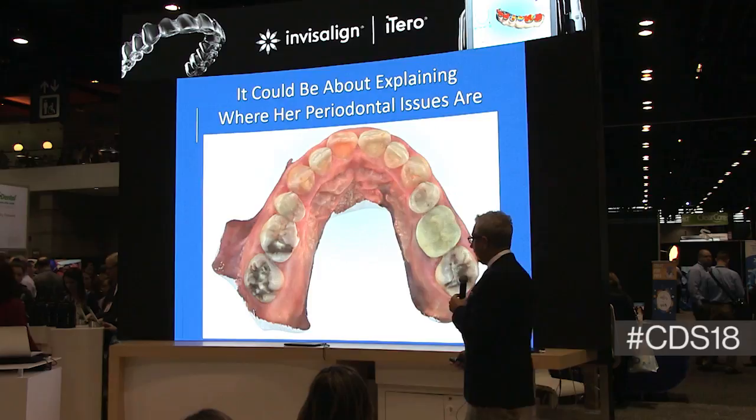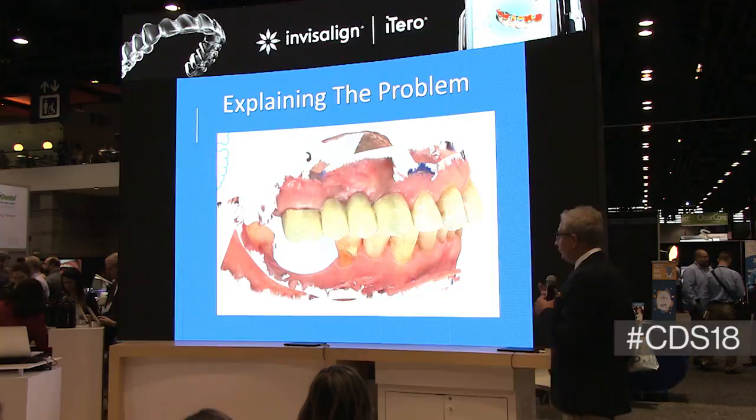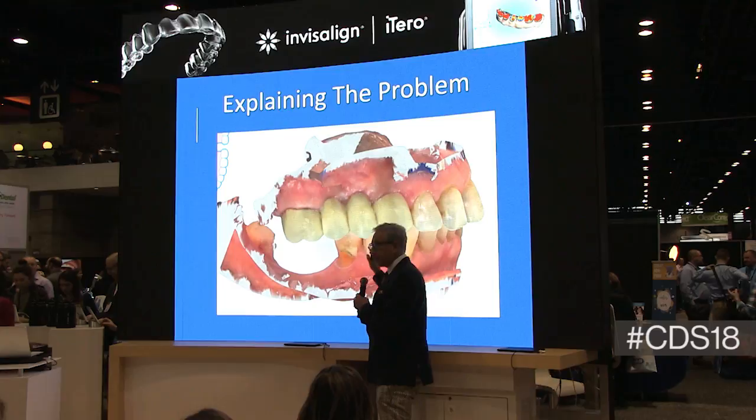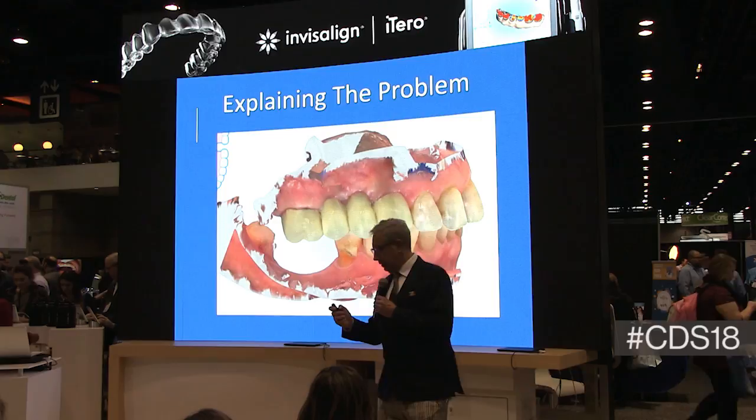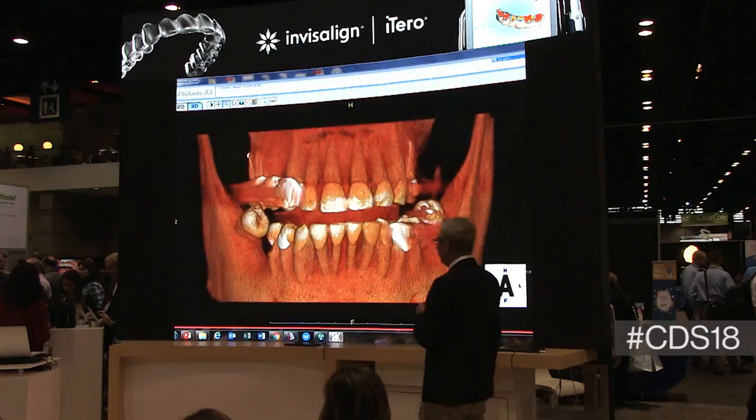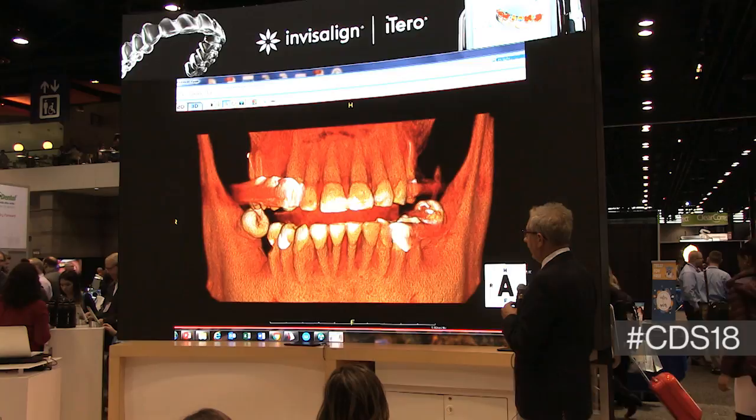This is Jean. Jean comes in, and she's got multiple problems. My assistant takes 5 minutes, 2.5 minutes upper arch, 2.5 minutes lower arch, and just creates the record. She's got a problem with tooth number 3. It's tender. So I try to explain to her without pulling her cheek over, what are we going to do? This is sitting right in front of her. Just pull it right up. And we take a cone beam scan. It's amazing what you will see on a cone beam scan. So we're going to focus on tooth number 3. There's your root canals.